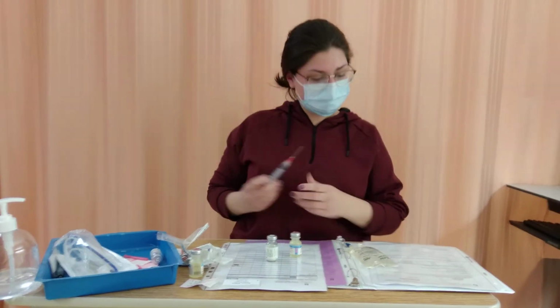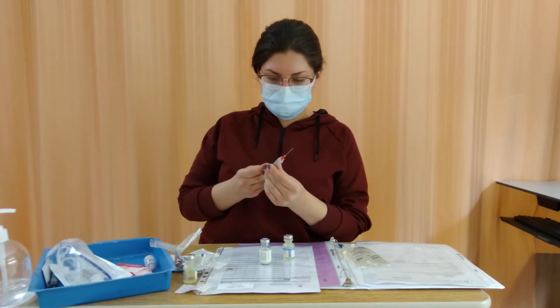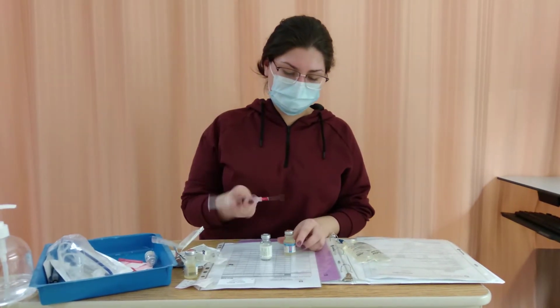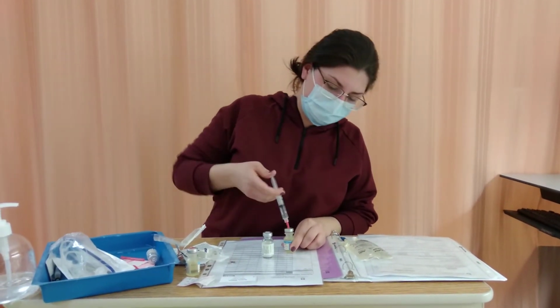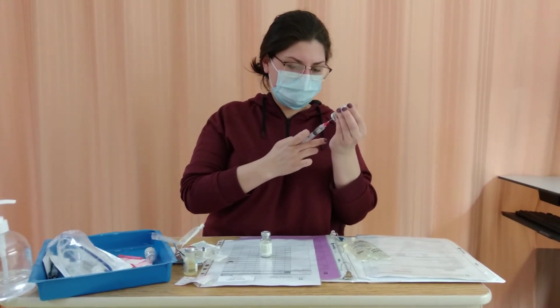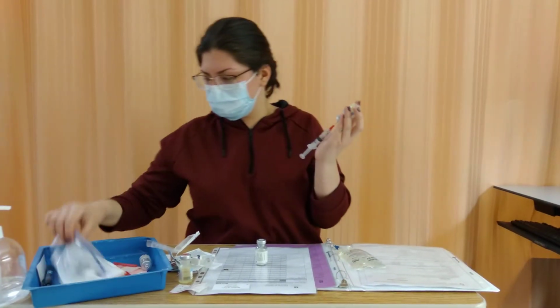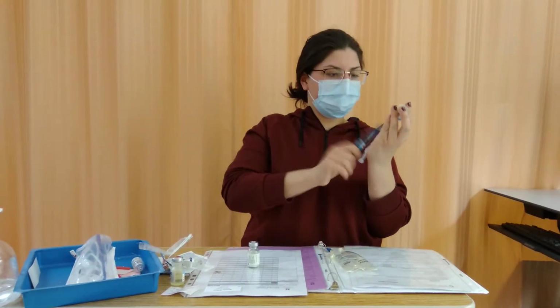Okay, so we're withdrawing 3.4 milliliters. Program the pump to flush 15 cc. So 3.4 milliliters of air is going in here. I'll make sure it's not expired. The integrity of the safety is not compromised. Then I will swab.